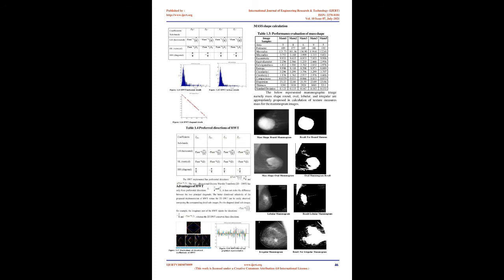The mean square error, MSE, and peak signal to noise ratio, PSNR, are the two metrics used to compare image processing, denoising, quality. The MSE represents the cumulative squared error between the denoised and the original image, whereas PSNR represents a measure of the peak error. The lower the value of MSE, the higher is the value of the PSNR. The mean square error, MSE, is calculated by using the following equation 1.1.